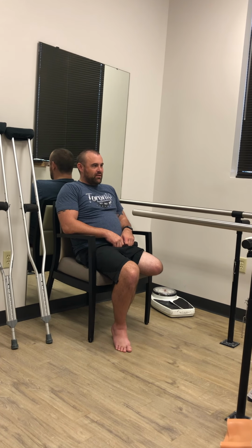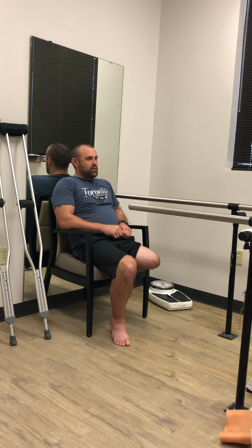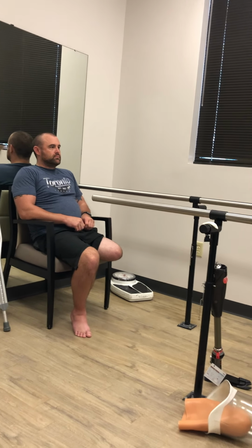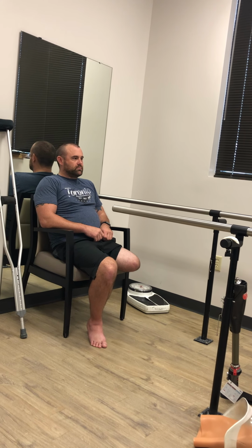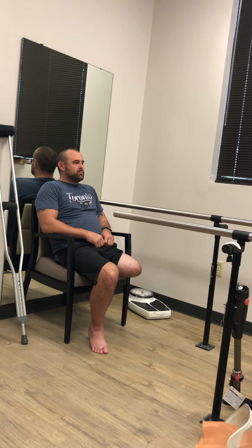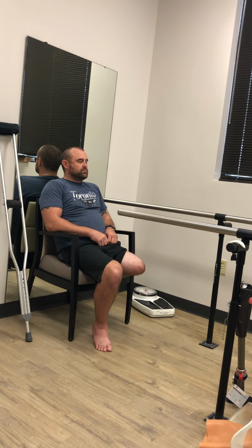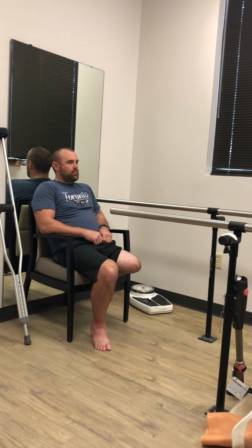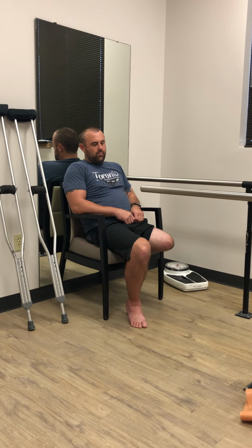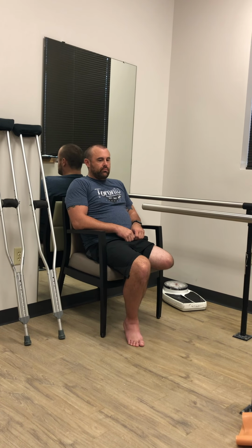I've got people that go on vacation or something like that, they just put a water shoe on it, and they wear a water shoe on the other foot, just like an aqua sock or whatever you wanna call them. Even flip-flops are gonna put you a little bit backwards. But this knee is gonna help you compensate for all of that. So you'll be all right. These are just little things we'll work through, we'll figure them out.